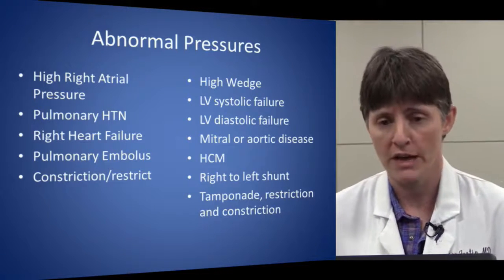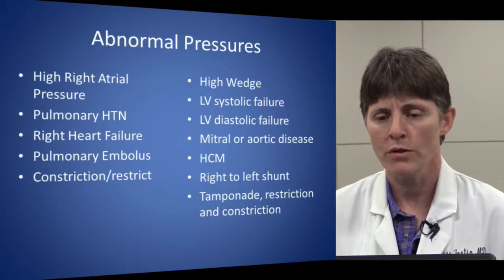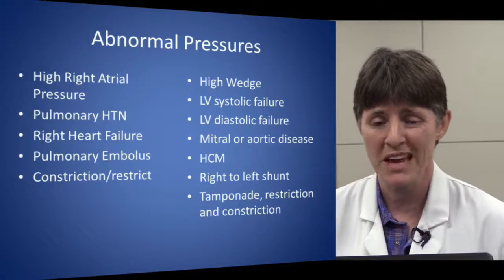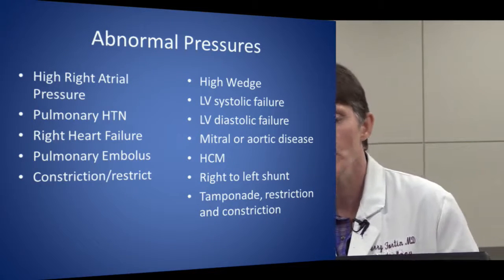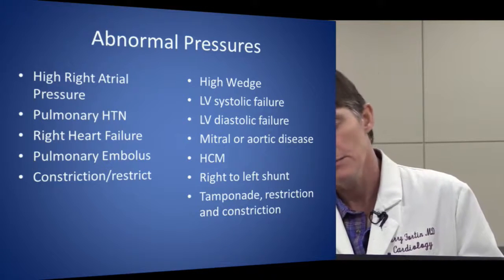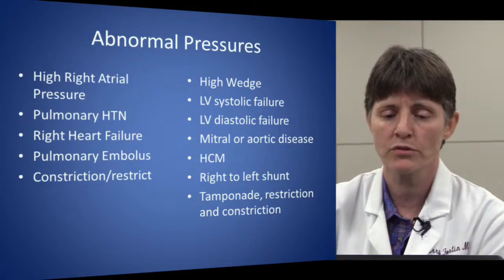High wedge pressures, again, heart failure is the predominant thing because it's common. So whether it's systolic heart failure or diastolic heart failure, they may look very much the same. Mitral disease or aortic disease can cause high left-sided pressures. And again, depending on chronicity or how high those are, they may cause high right atrial pressures.